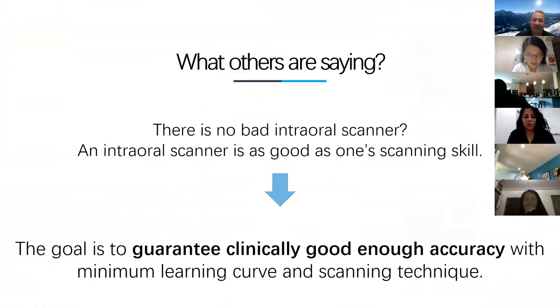The thing is, we need accuracy, and this accuracy nowadays is not just, as people think, something the scanner gives us. A big part of the accuracy is the software, the matching software. You have to imagine, these are all single pictures which have to match together. There's an algorithm behind it matching them. That's what gives us the accuracy, and not a scanner like the one you have in your hand. That has nothing to do with accuracy. It's the software putting it together.